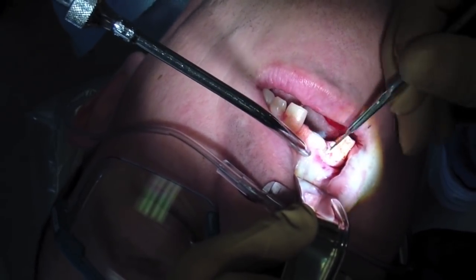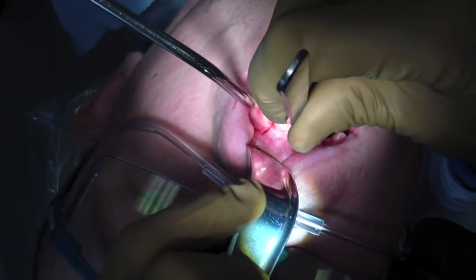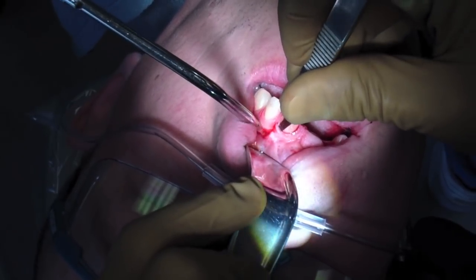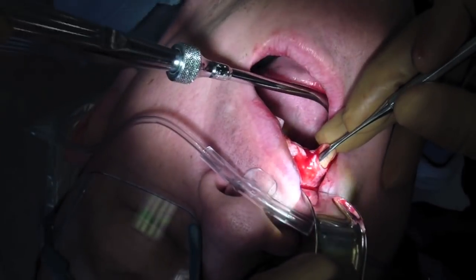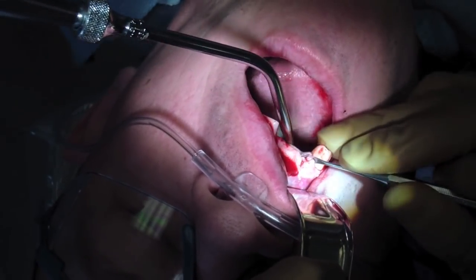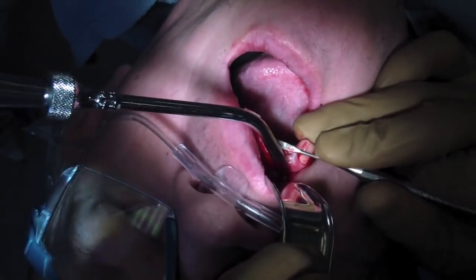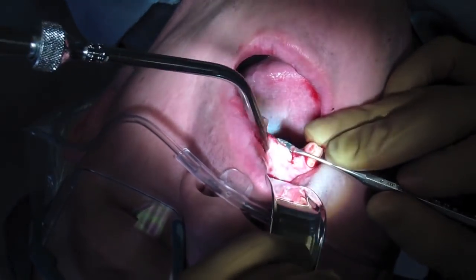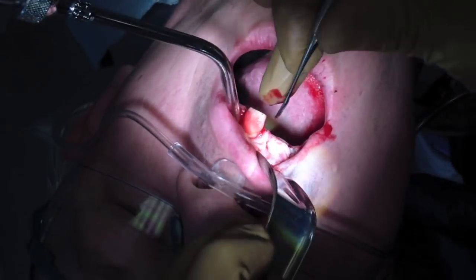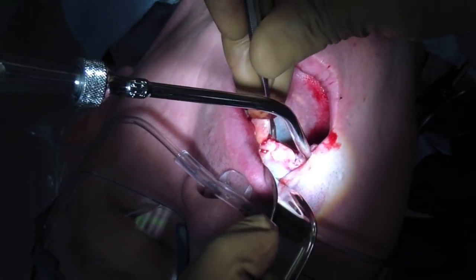I was talking with the old surgeon that I first assisted on a ramus graft, and there's a little technique — I posted a video about it — about making sure you can get that flap all the way over that bone graft. It's going to be those two little mesial nicks of the flap at the apical base, and also the periosteum release incision. Those two things are critical to be able to get all that mucosa over the bone graft and primary closure with the palatal tissue.